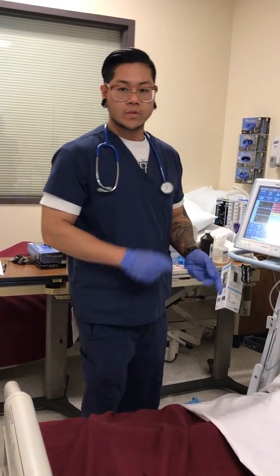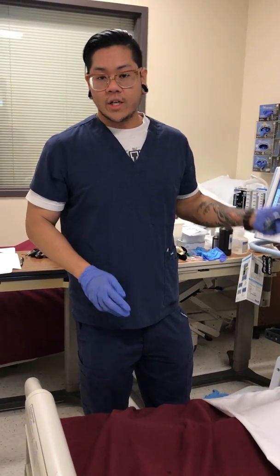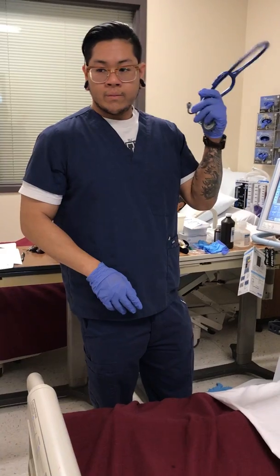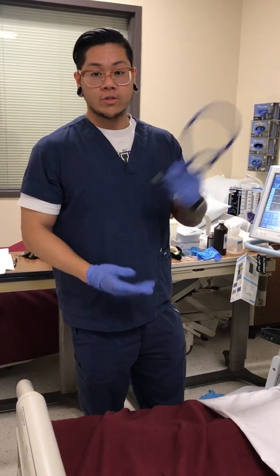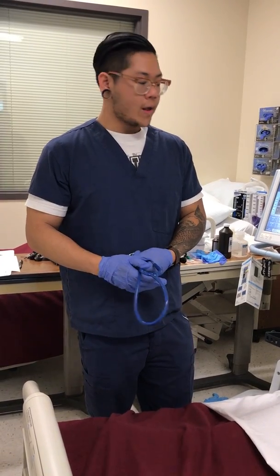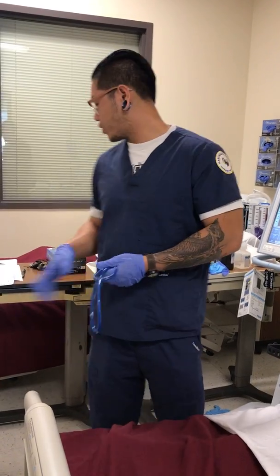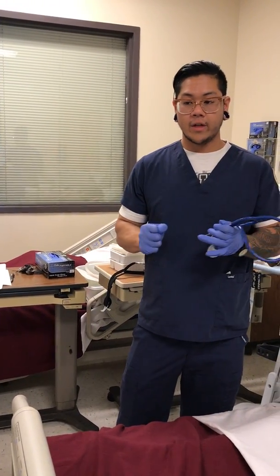And just take out your gloves. Already reassessed. If you do need to change any settings, make sure to change them. But then you also need to let the physician know that you've made some changes. Always talk to them. Okay, take all your necessary equipment out, wash your hands again, and then remember to chart.